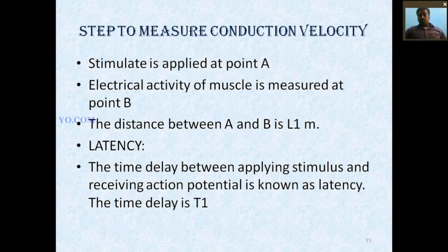Already I told you the stimulus is applied at point A. Then the electrical activity of the muscle is measured at point B. The distance between A and B is L1 meter. Then what is latency? It's an important two-mark question.